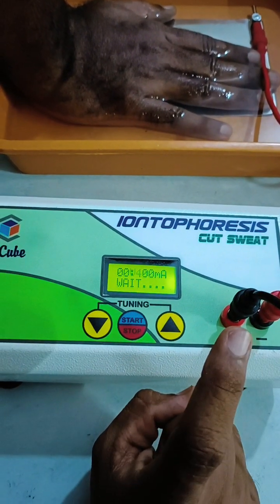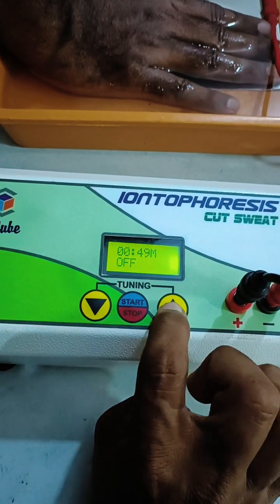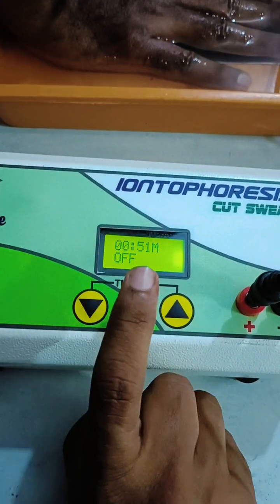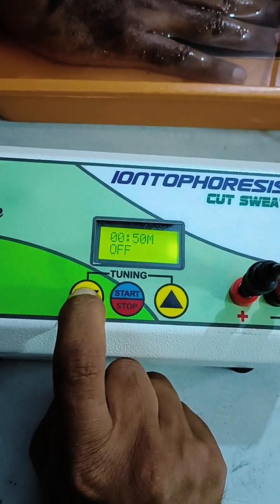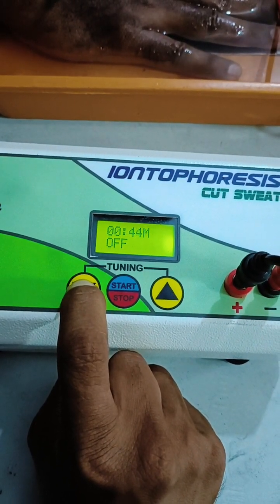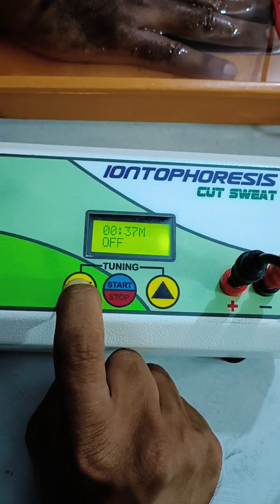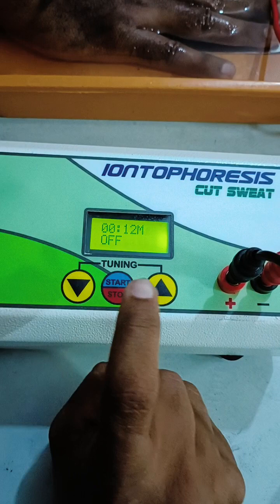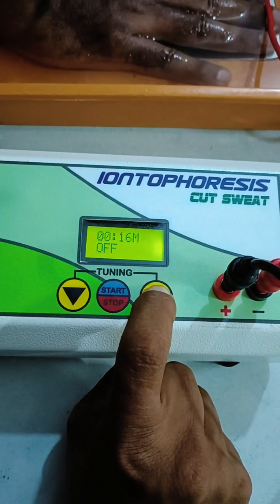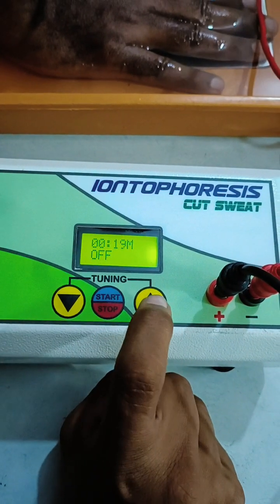Once saved, the device will display the set treatment time duration. You can change the time duration using the increment and decrement functions. I have set the treatment duration to 20 seconds for demonstration purposes. Normally, you take treatment for 20 minutes on normal polarity, then 20 minutes on reverse polarity. Always follow the advice of your practitioner or prescribing doctor for safe operation.